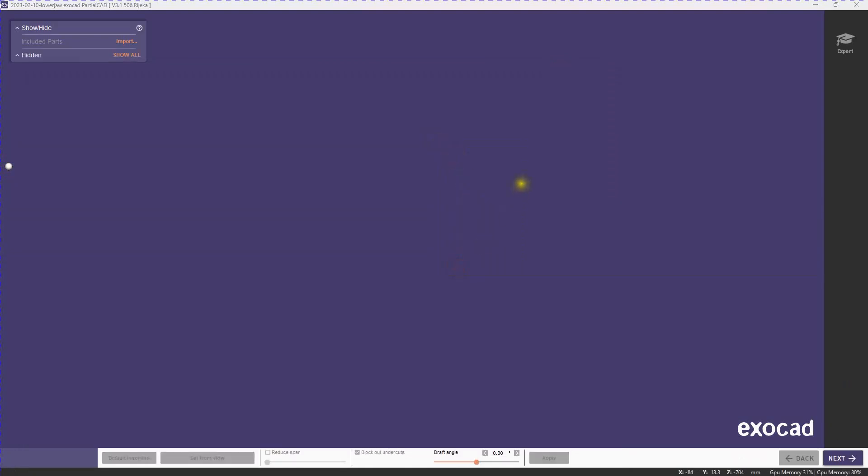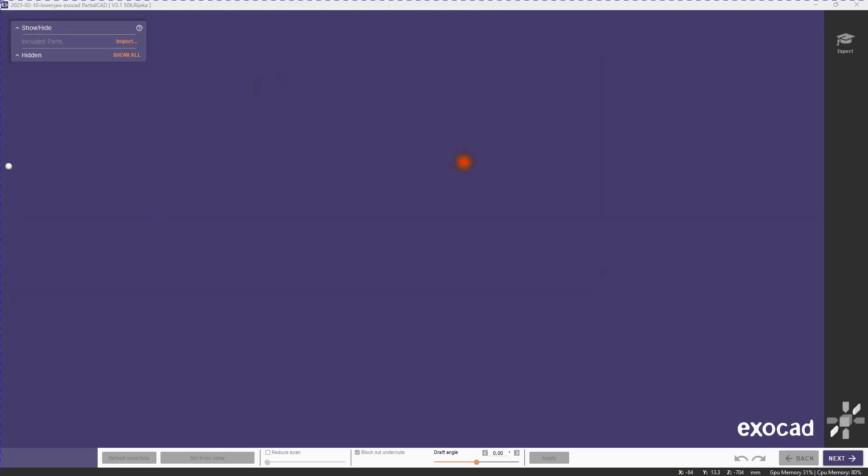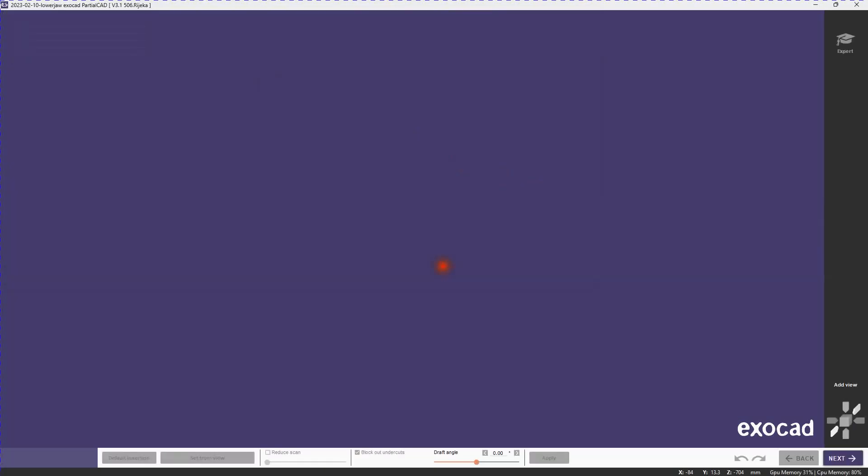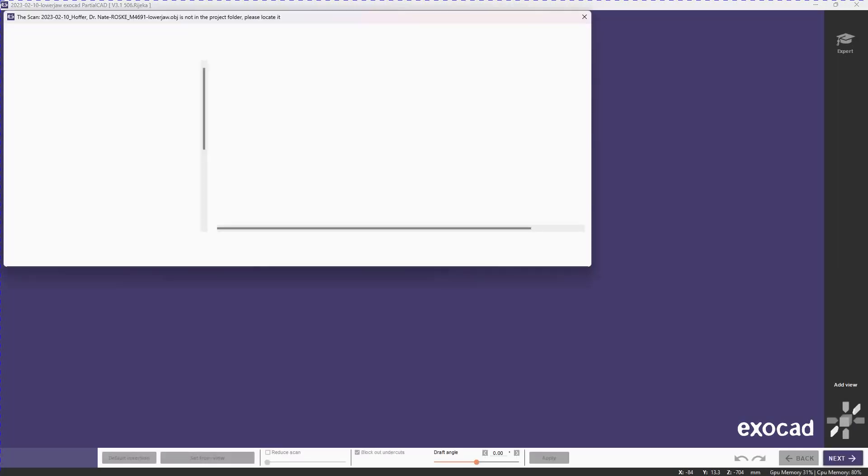So we're going to load up our project. It's important that this project is the project that was used to make the bar because that is the one where the screw channels are in. There's nothing typical about this project so we're going to have to load everything more or less manually.